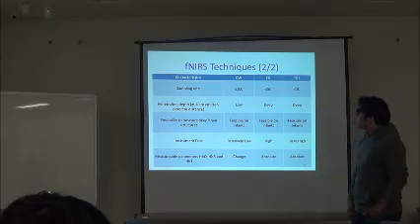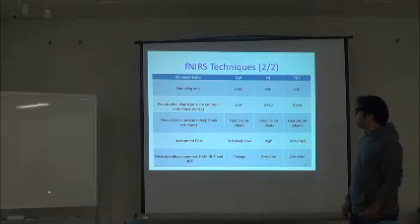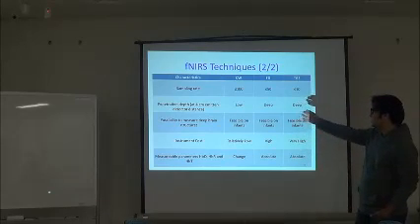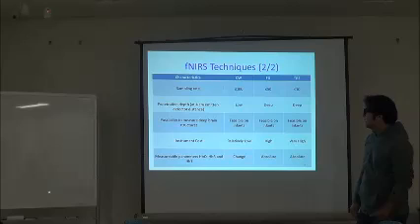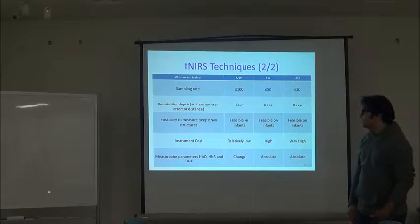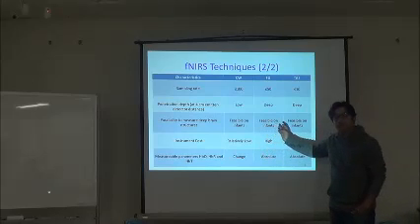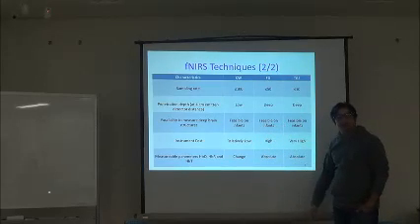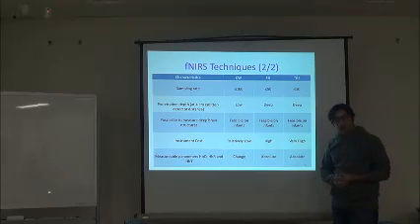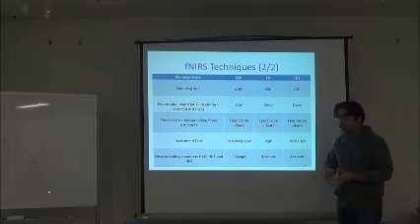Well, in case of penetration depth, it's almost the same in all cases. We just cannot say it's low, deep, it's almost the same, at the 4 centimeter source detector distance. Possibilities to measure deep brain structure is not possible in adults, but yes, in case of infants, because their head is small, we can go into the deep brain in case of kids, small kids, infants.